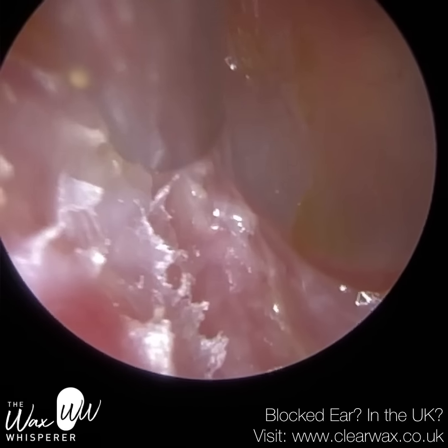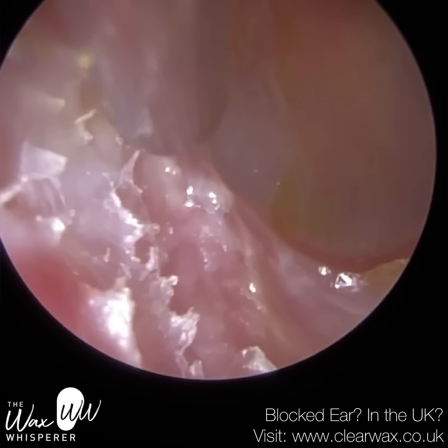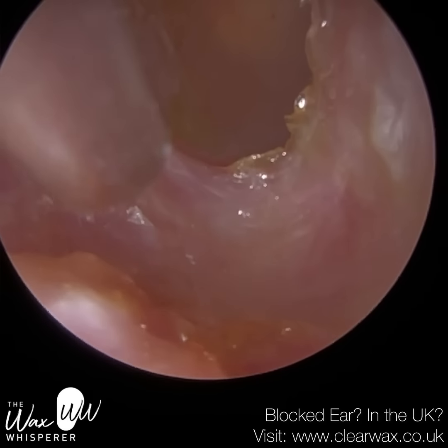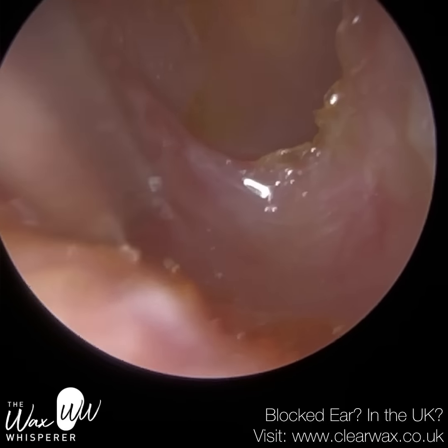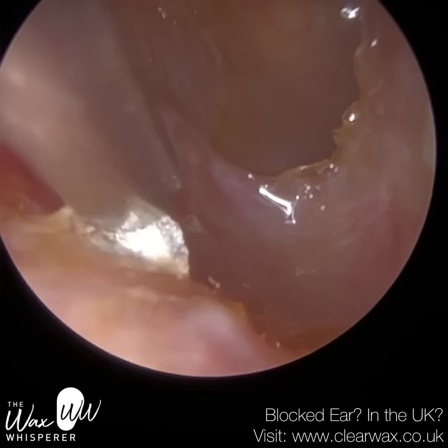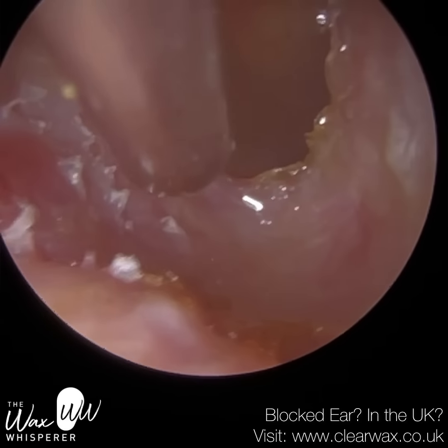I mean, some of the skin, because of the humidity, started to almost become very moist and damp and sticky. And at that stage, you've got to be careful because they can release some proteolytic enzymes, which can then create an ulceration of the skin. So just on the other side of this ridge, there's some keratin here, so I'm just peeling that away.